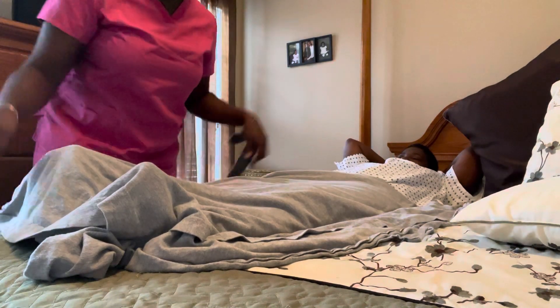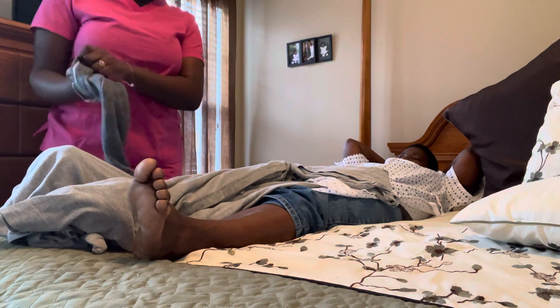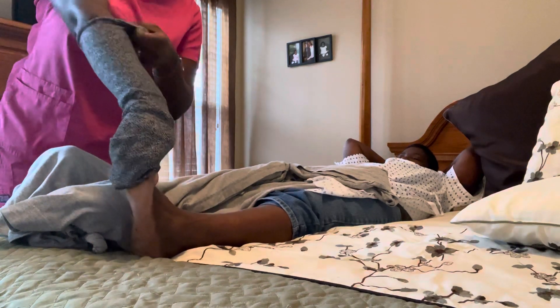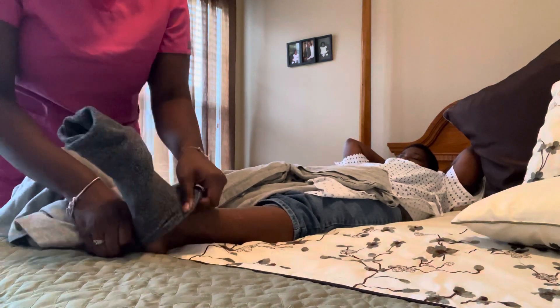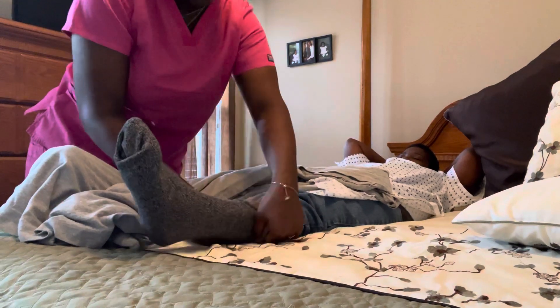I'm going to also make sure not to overstretch the stocking. Then I'm just going to recover the leg and do the same thing on the other leg, turning the stocking inside out and placing it on the patient's foot, following the same guidelines as before.